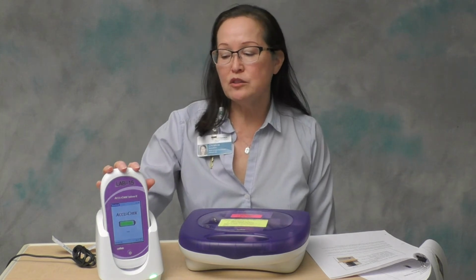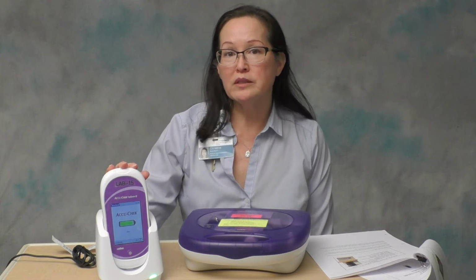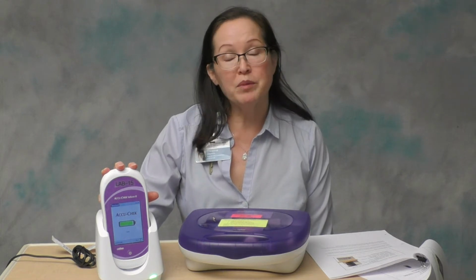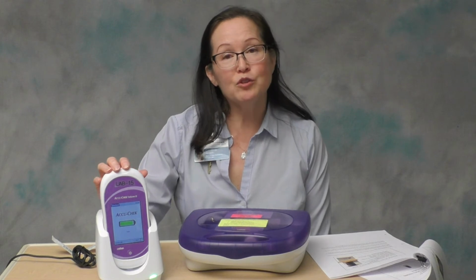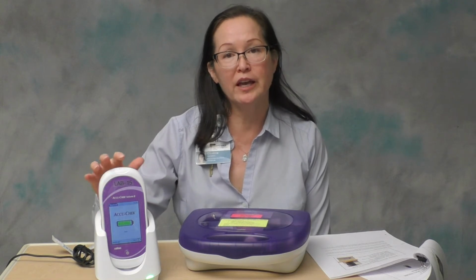So when you dock these instruments, do not walk away from it until you see that it is in this docking screen. That way you know the battery is charging and it will be ready for use when someone needs to use it. As I mentioned, the number one problem we have with the meters is that they do not get docked correctly and the battery goes dead. Then when you have a patient that is crashing and you need to check their blood sugar right away, you will not have an instrument that is ready for use. So do yourselves and your coworkers a favor, don't walk away from the meter until you see that the meter is docked correctly and is recharging.